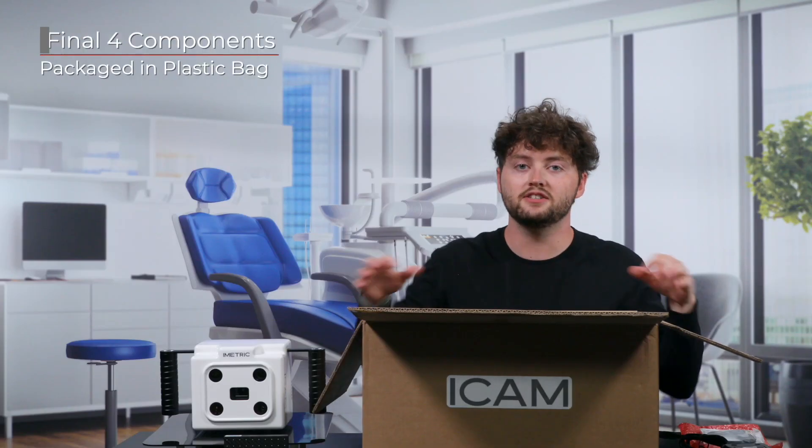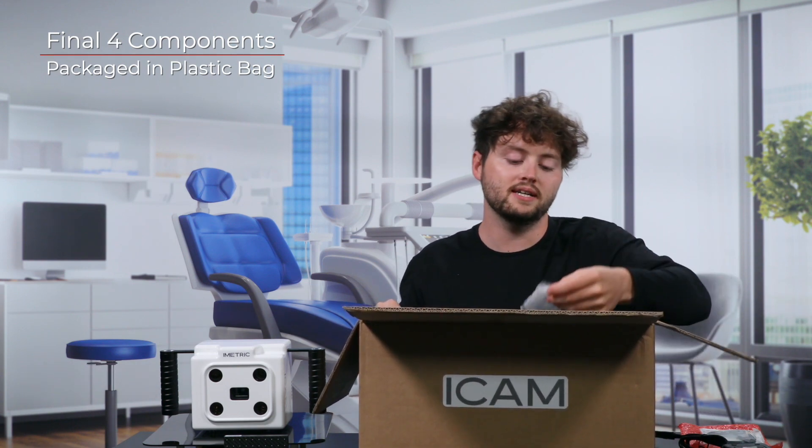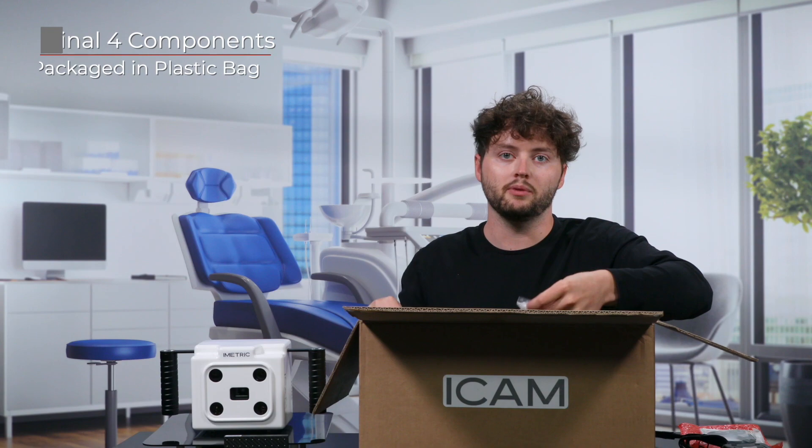Next, let's dive into our final four components. They will all be packaged together in a singular plastic bag at the bottom of the shipping box.